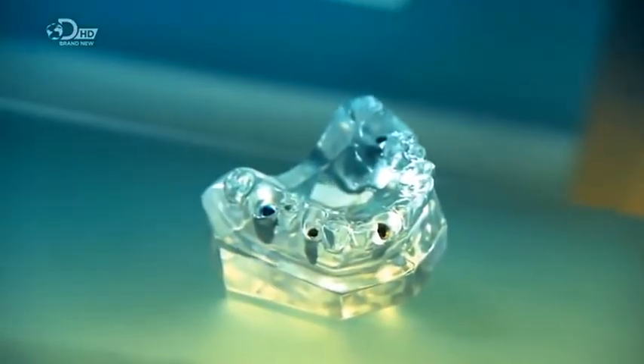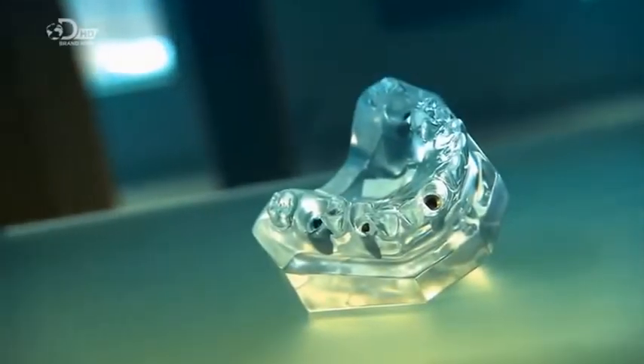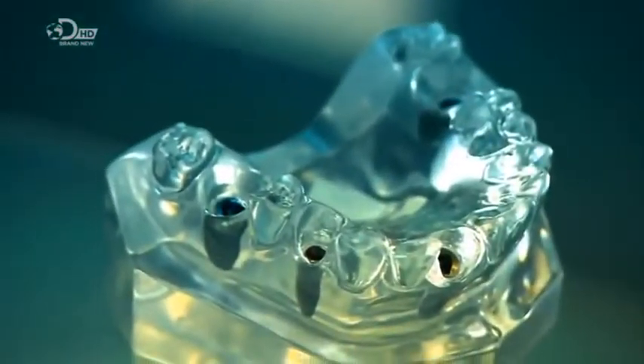The ancient Mayans hammered seashells into their jaws to replace missing teeth. That probably hurt. Those seashells were likely the first dental implants. Today, titanium tooth implants fill the gaps nicely.